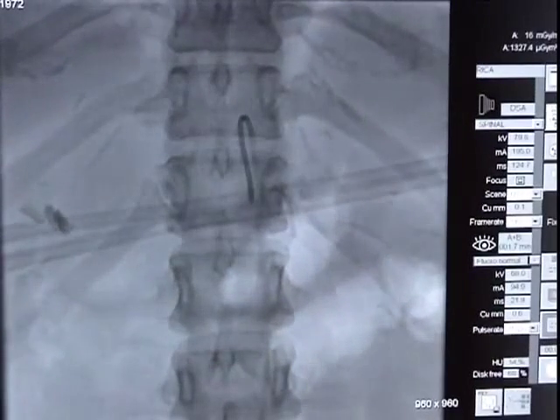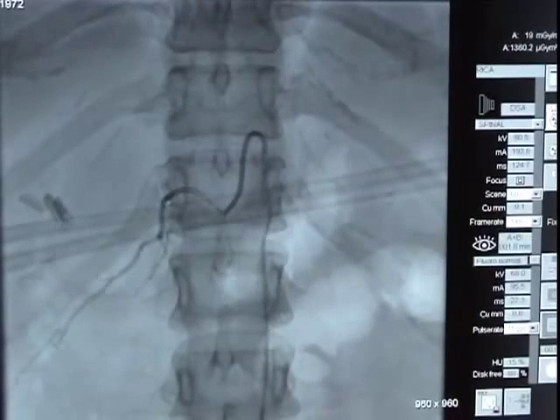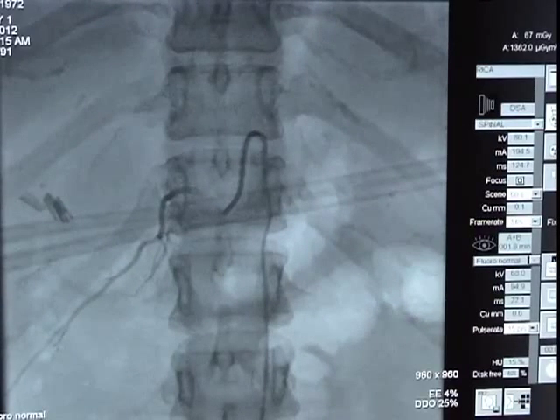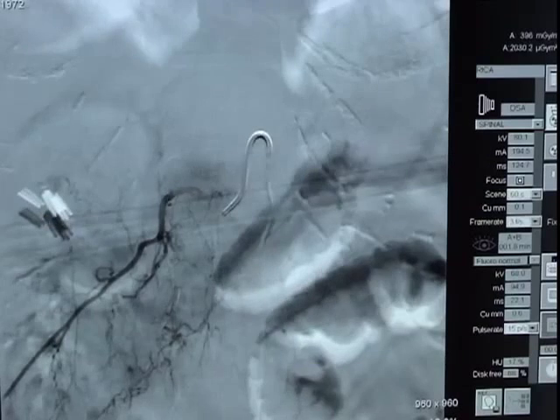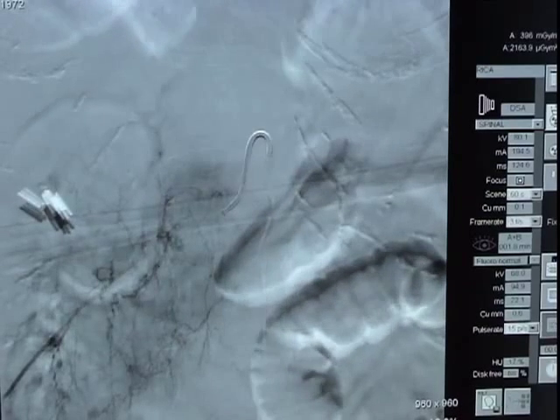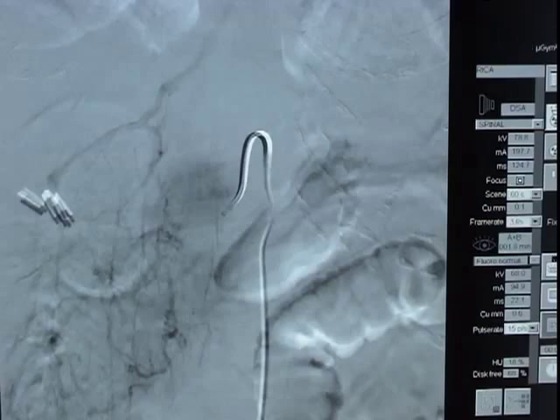A total of 25 to 30 individual vessels will be studied. Here we can see dye being injected into a spinal radicular artery. Now a formal run will be done to document the image, and this will be saved for later review.